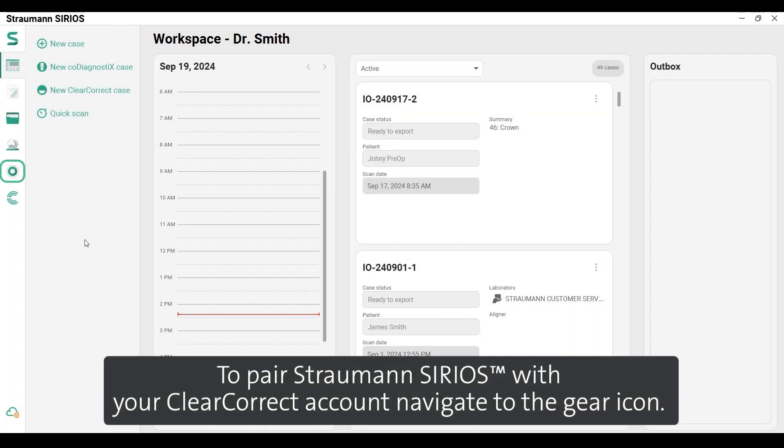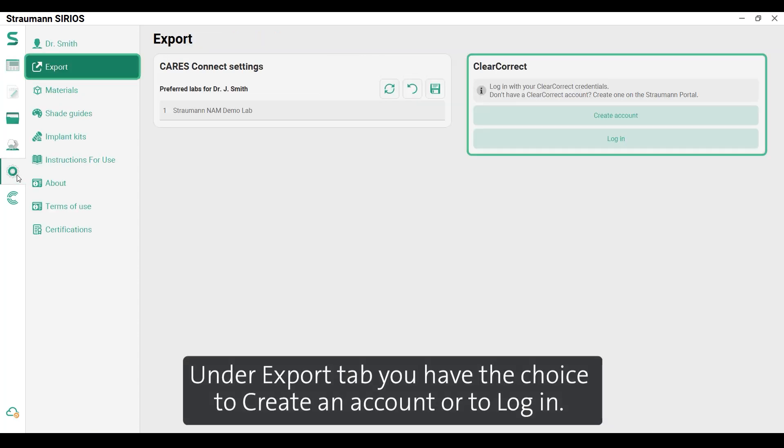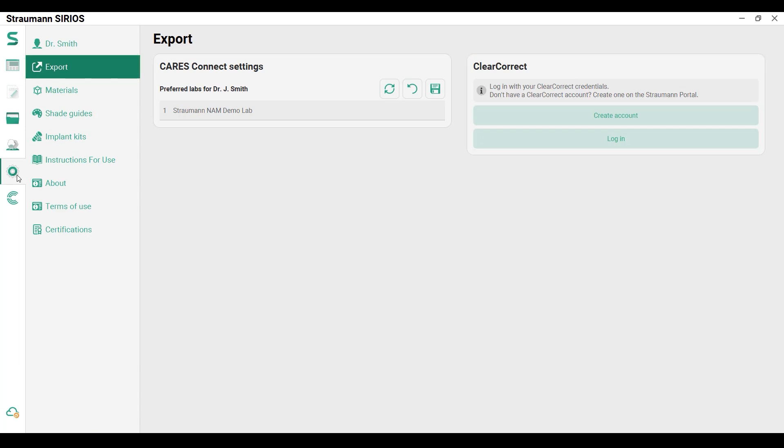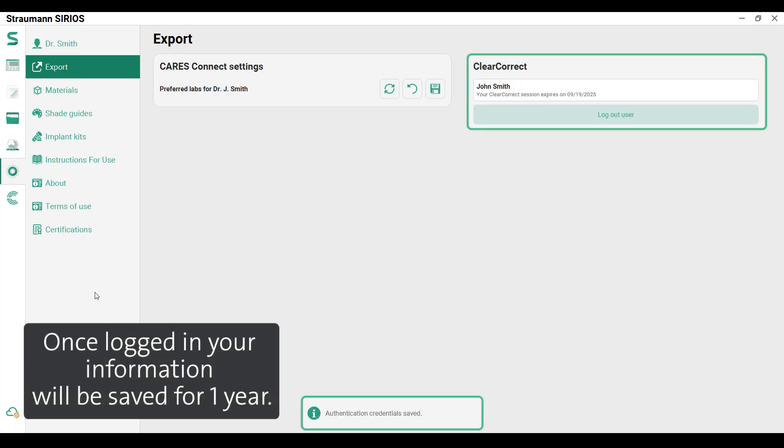To pair Straumann Sirius with your ClearCorrect account, navigate to the gear icon. Under the Export tab, you have the choice to create an account or to log in. Once logged in, your information will be saved for one year.